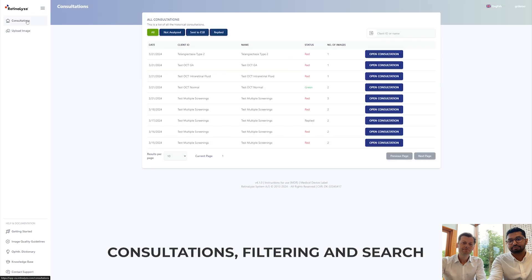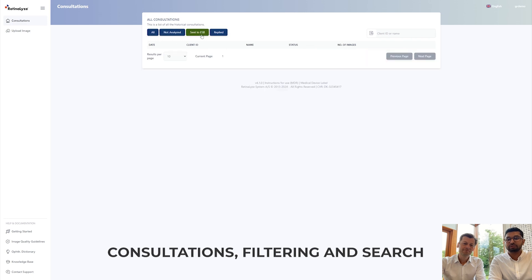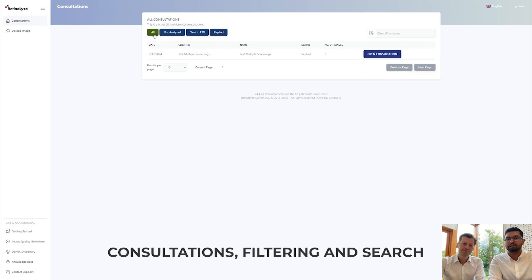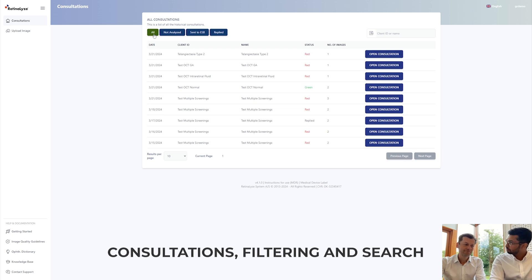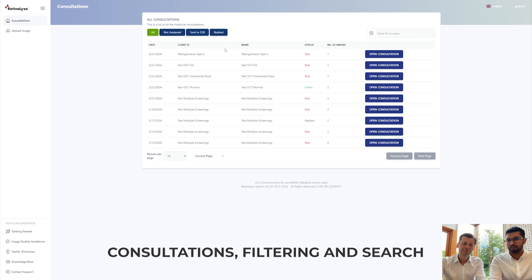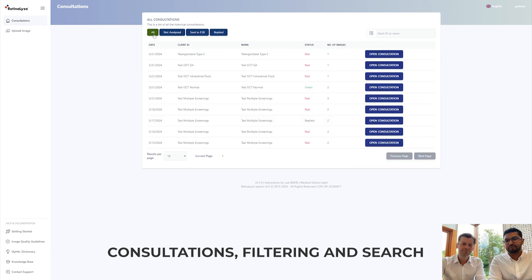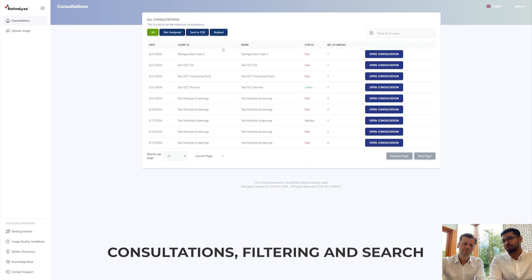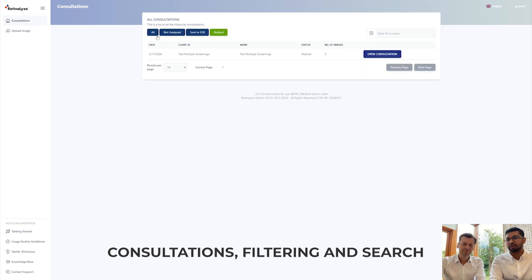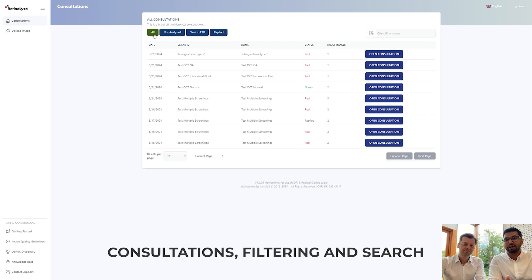This is the screen you see when you log into the system — the consultation screen, where you see all the patients that have visited you today. You can see their name, client ID, the date they visited, and an aggregated status. A red result means something you should act on. You can sort using filters at the top to see what's been sent to telemedicine, what you haven't analyzed yet, and so on — easy to filter, search, and find the necessary consultation.